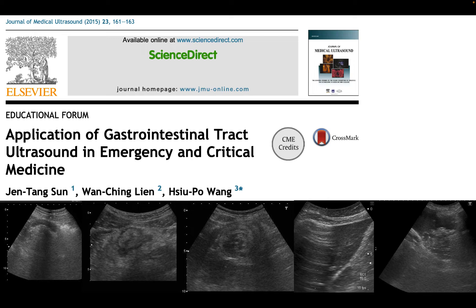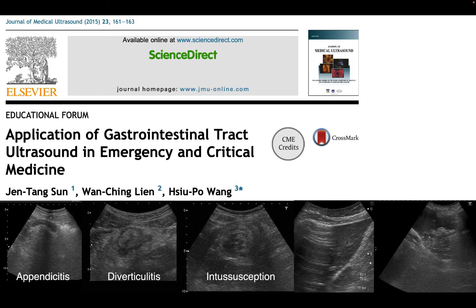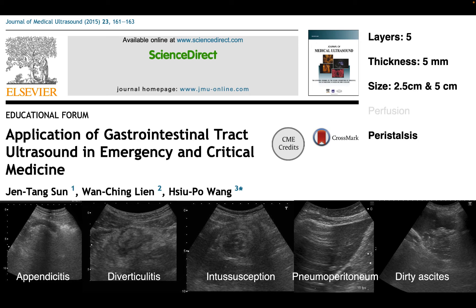Emergency physicians use ultrasound to diagnose appendicitis, intussusception, and extra-luminal air, and dirty ascites from patients having pneumoperitoneum. In order to recognize these common diseases, we have to be familiar with GI structures.